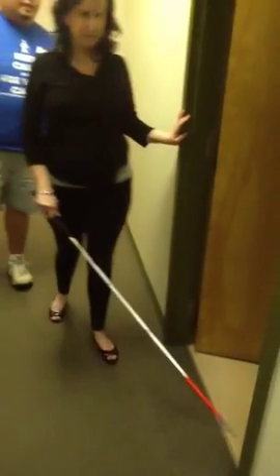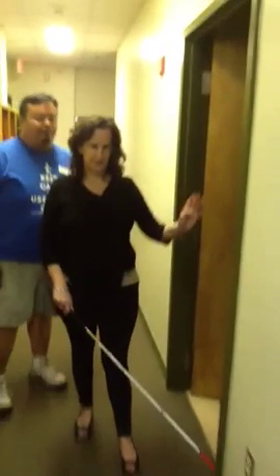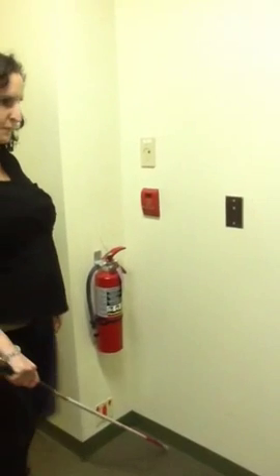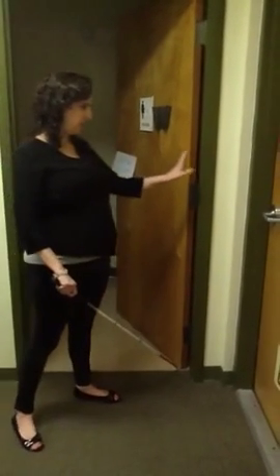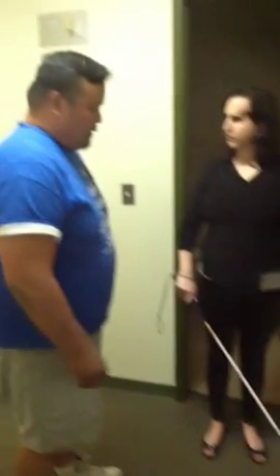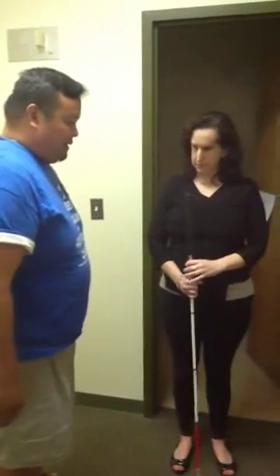Another doorway. This is the men's restroom. A little turn. Another doorway. And this is the women's bathroom, but it's currently out of order. So let's go ahead and stop here. Let's go ahead and hold the cane up and down so it doesn't trip anyone.